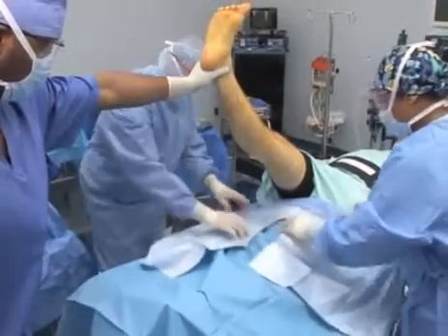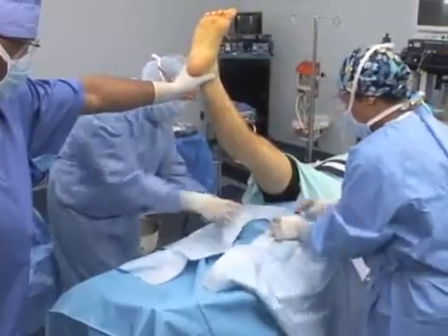A split drape is secured around the proximal, upper part of the limb.